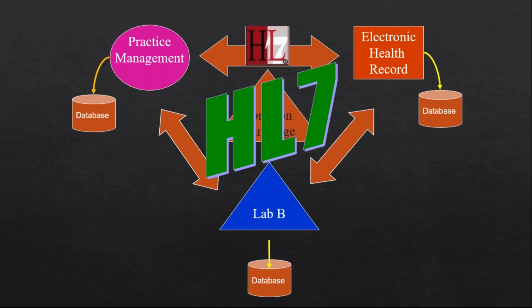So what happens here is, practice management will extract the data, convert the data into HL7 and send it over. Once the message is generated from the PM application and converted into HL7, that HL7 message will be sent over to EHR, and practice management's work is done. They won't bother about how EHR is interpreting that message, because EHR also should know HL7 to grab the HL7 message and insert the data into the database.